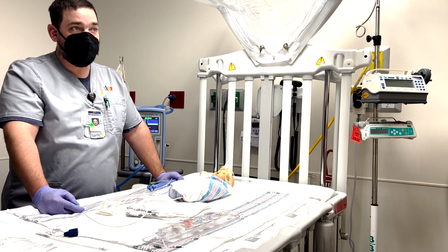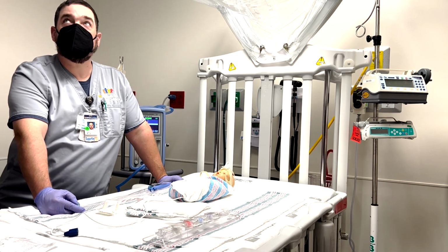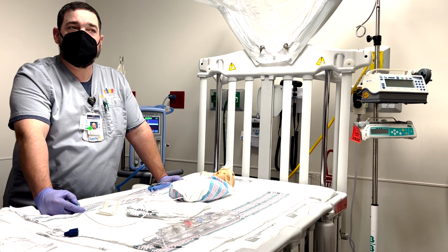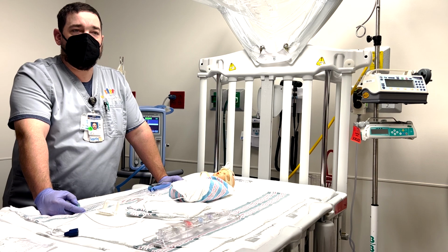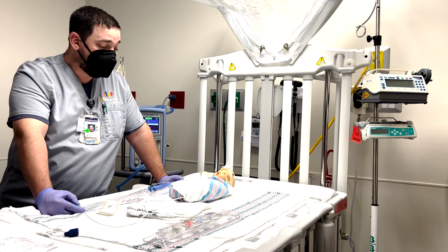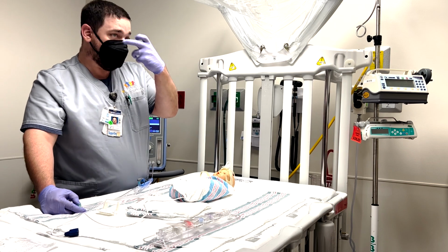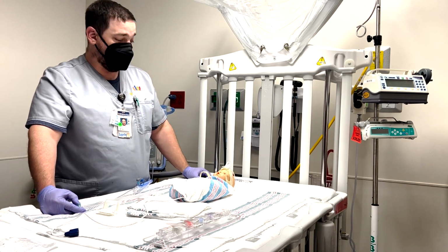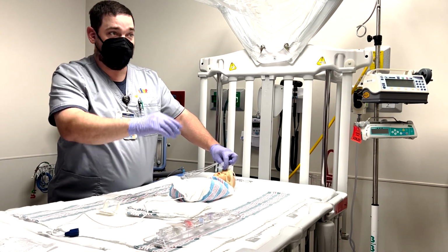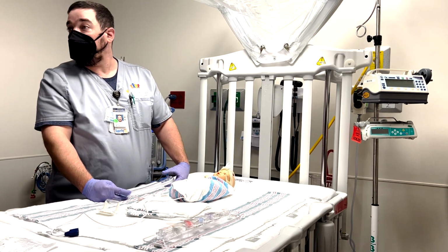Do you feel like babies usually do well with this, agitation wise? Agitation wise, it depends on the kid. And again, for the most part, once you get them settled in, they tend not to worry too much. I will say that I lean towards this, because when I start going towards Trilogy CPAP or the mask CPAP, they start losing their line of sight and then they panic worse. So at least with this here, they can see around it, and there's their field of vision, and they notice caregivers, they notice family. It's more helpful to them in that respect.